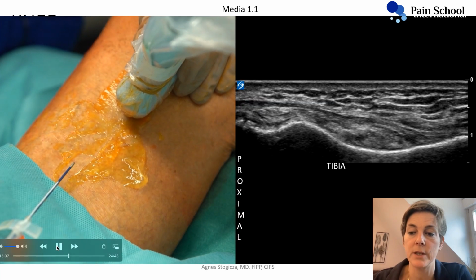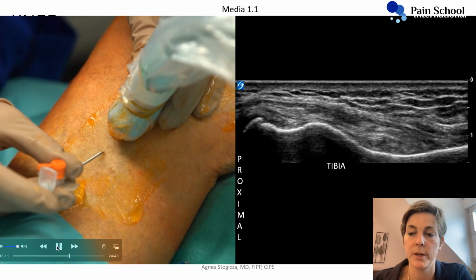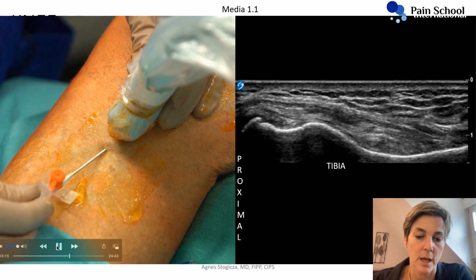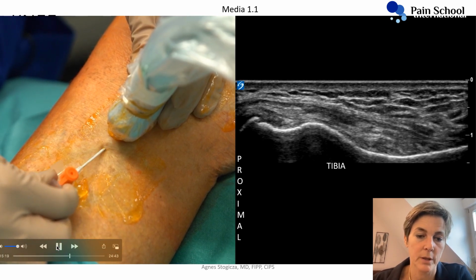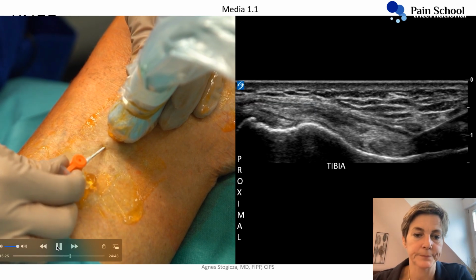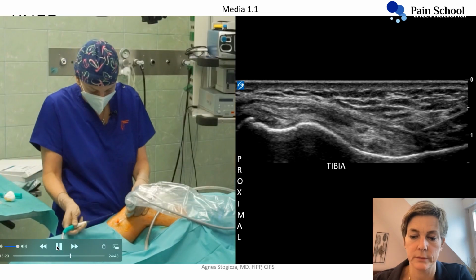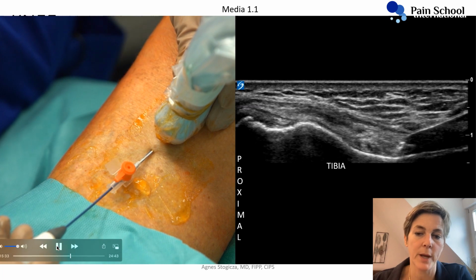This is denervation of the inferomedial genicular nerve. You can see the tibia. This is where the tibia shaft and epicondyle meet. Here I am putting in the introducer, looking for a laser pointer, all the way to the target, and then the cryo probe gets inserted.